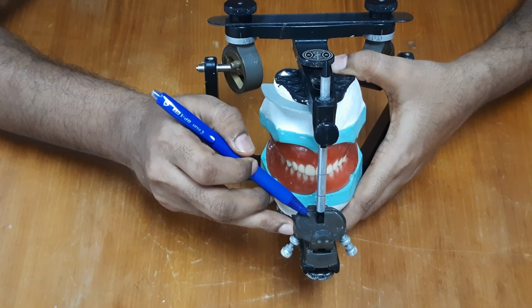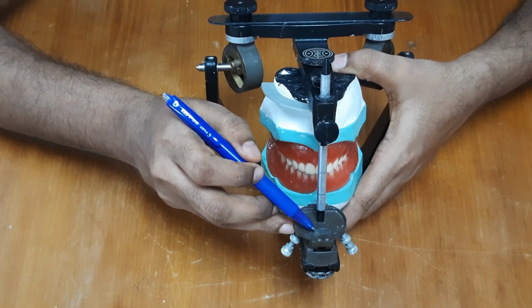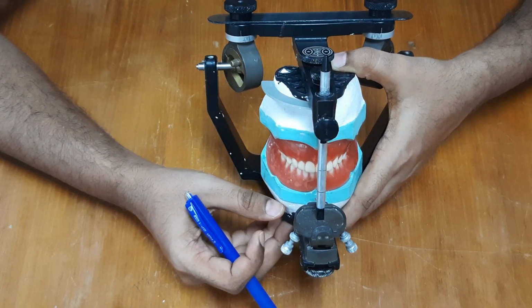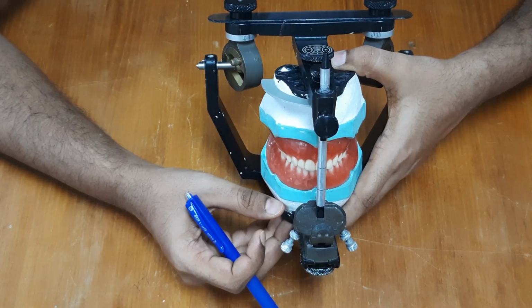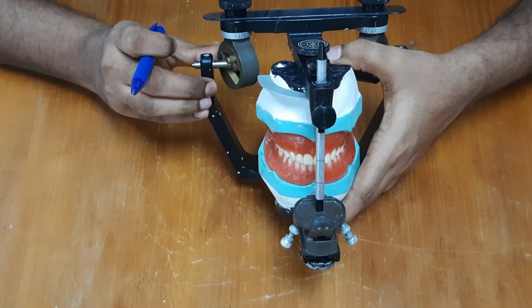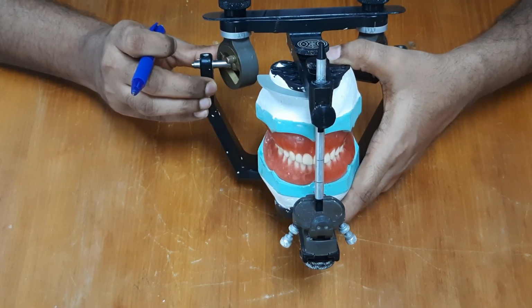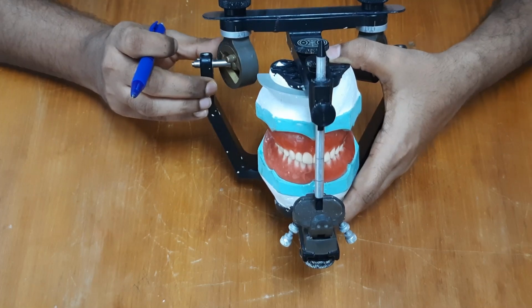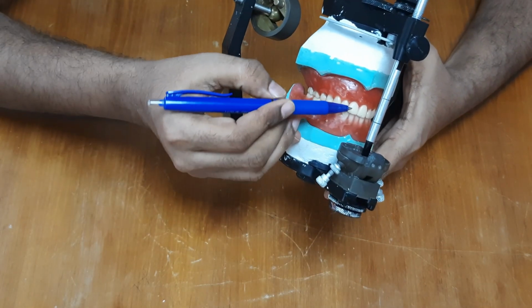After this, we can do the programming of the articulator with the protrusive and lateral interocclusal records obtained during graphic tracing. These are used to program the articulator. After programming the articulator and selecting the H value and calculating the L value using the formula L is equal to H by 8 plus 12, then we do arrangement of the anterior teeth.